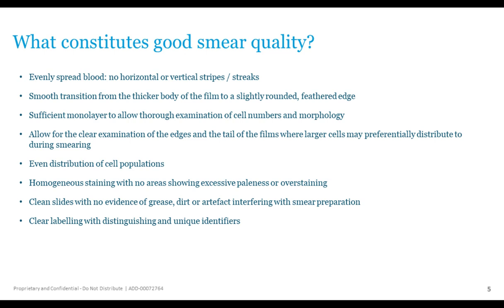One way to assess smear quality is to look at artifacts or cell shape. For example, if cells appear elliptocytic but all point with their long axes in the same direction, it suggests a spreading artifact, and one would have to be cautious about drawing a conclusion of hereditary elliptocytosis. Knowing we've got a good quality smear is the starting point.